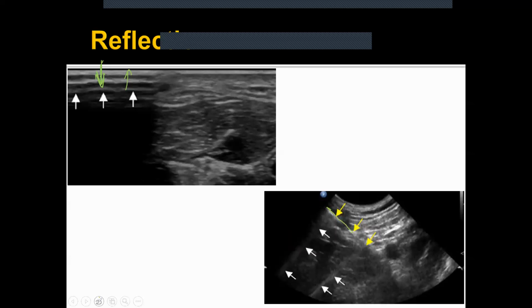I'm going to erase that drawn line so you can see it. But you can see here that there's a line, and behind it there's another acoustic shadow, an area where there's dark. And you can see that because of this grey line over here, where suddenly everything's becoming brighter.